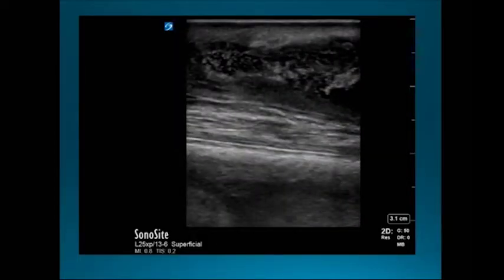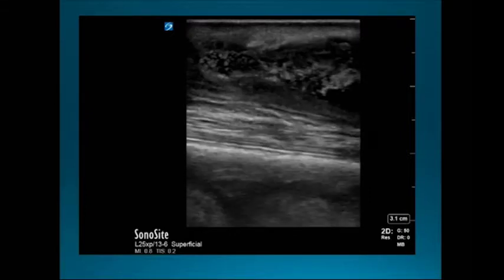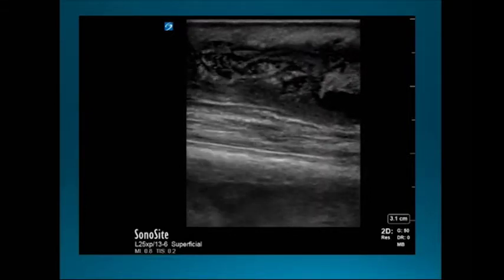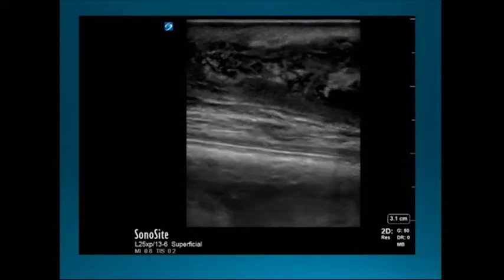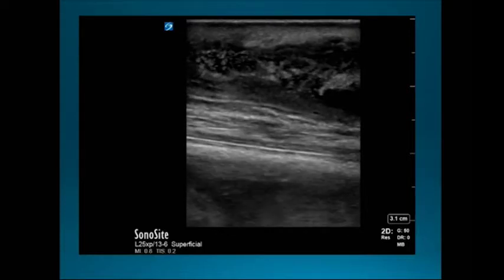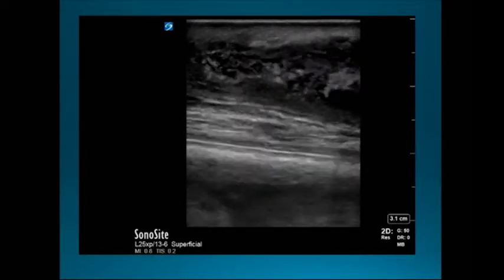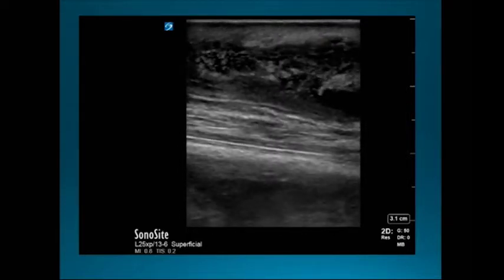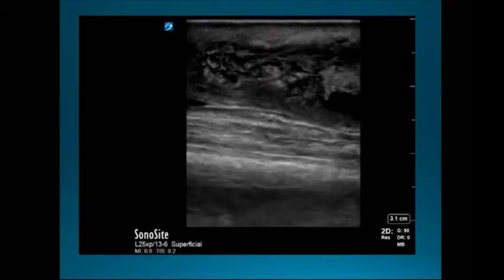Now, where this is also helpful is in figuring out, just like the thoracentesis and the paracentesis, when you shouldn't be doing that I&D, all right? So this is on somebody's arm, and we're taking the probe and gently pressing on their arm with the probe. And you guys see this nastiness swirling around. What we call this is sonographic fluctuance. This is liquid hot magma going back and forth beneath the surface.